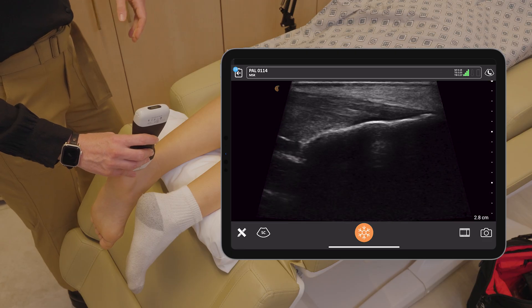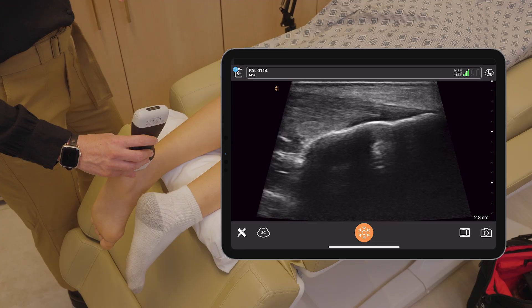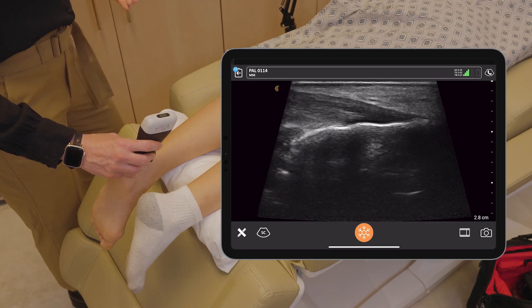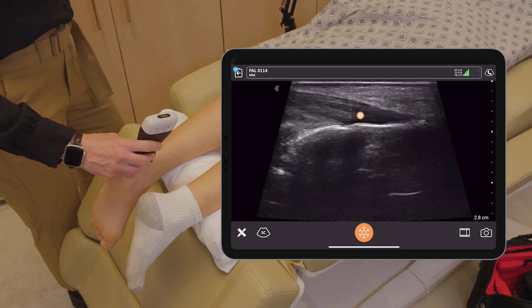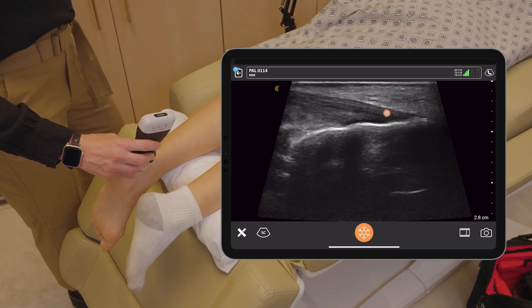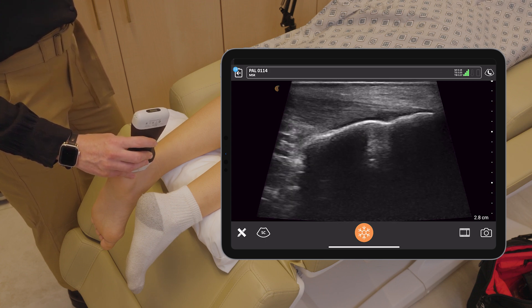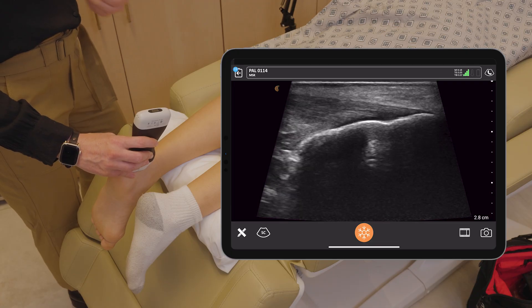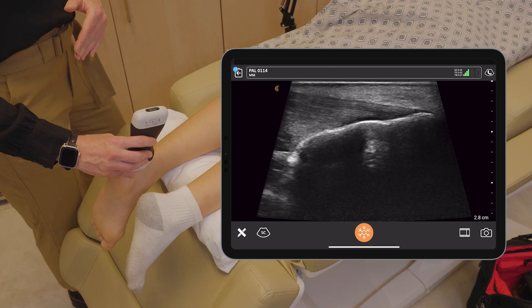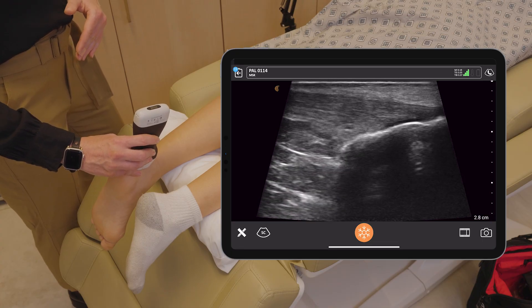One thing I want to point out here is a normal finding called anisotropy that we commonly see with tendons. Basically, depending on the angle of my probe, we are seeing this hypoechoic area, and when I get the ultrasound beam to be perpendicular to the tendon, it goes away. This is a normal finding — it's not a pathology, it's not a tear.